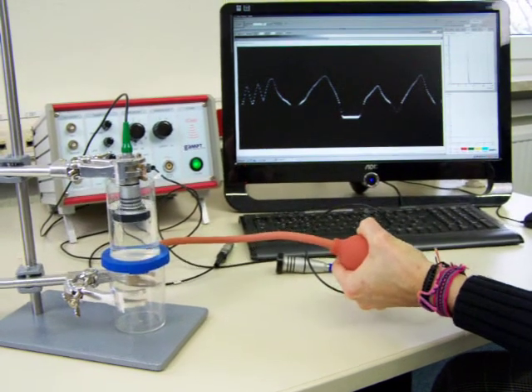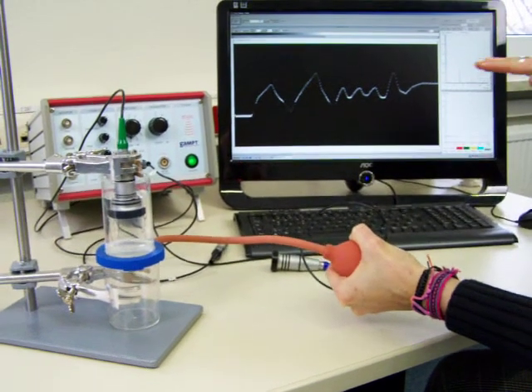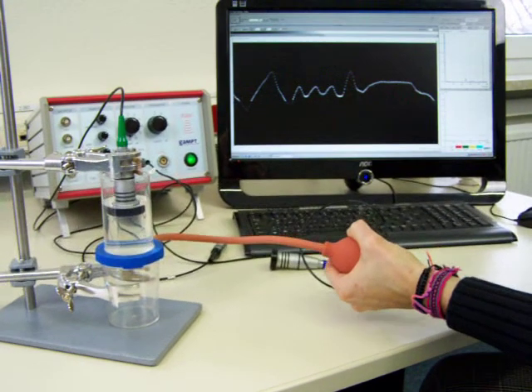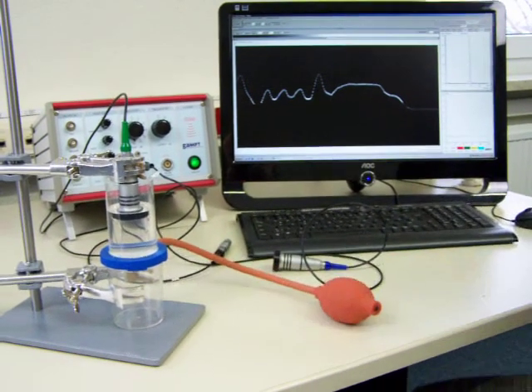Or steep signals or just really flat signals, depending on what you want to explain. You can stop and you have the signals of the heart.